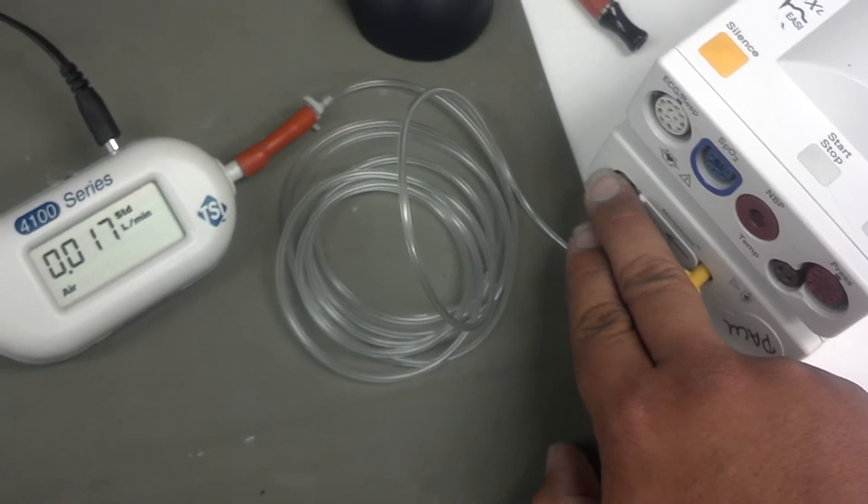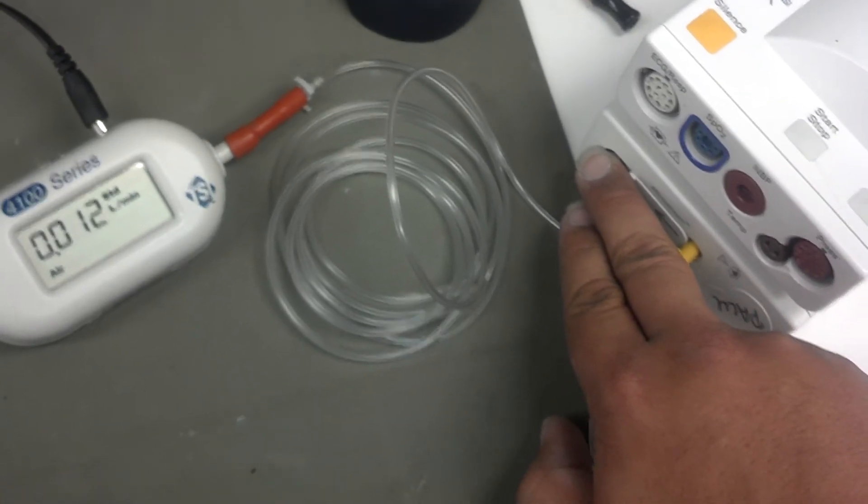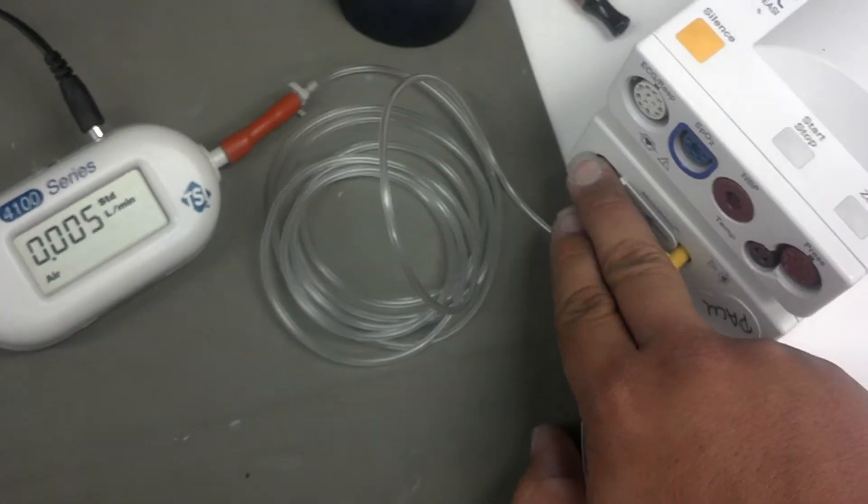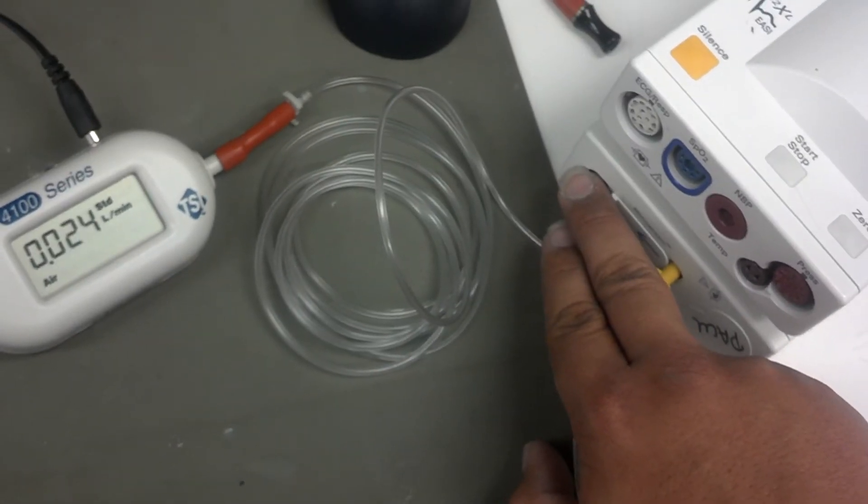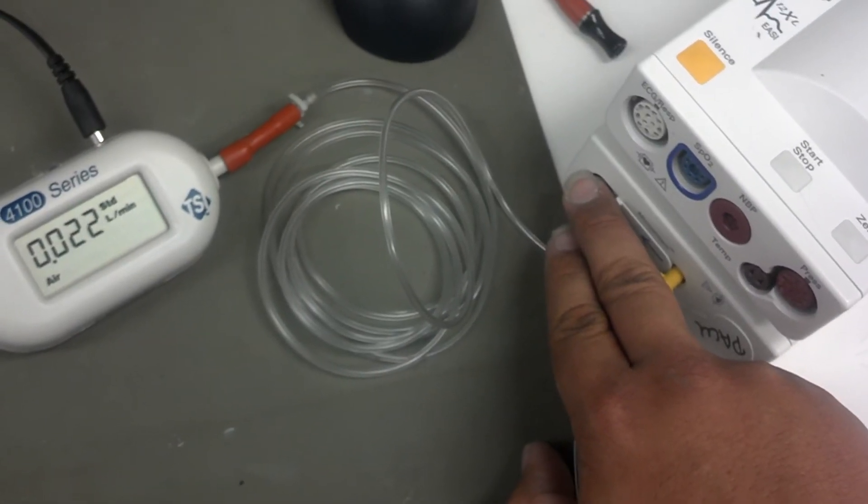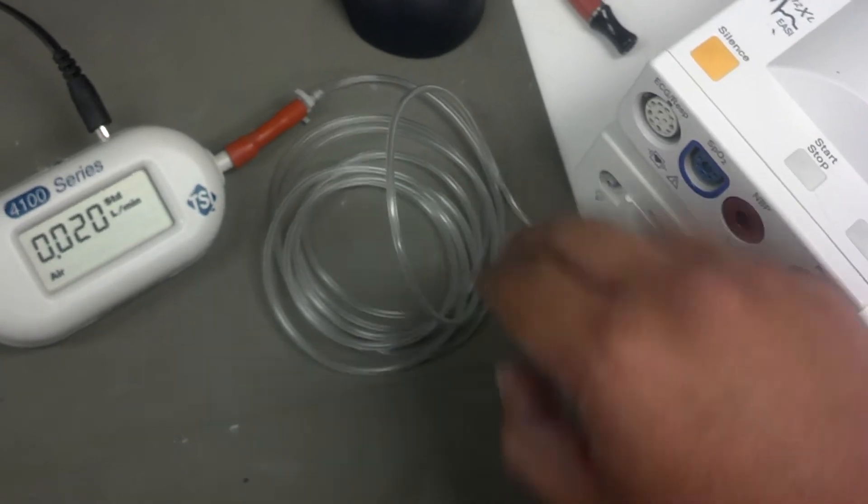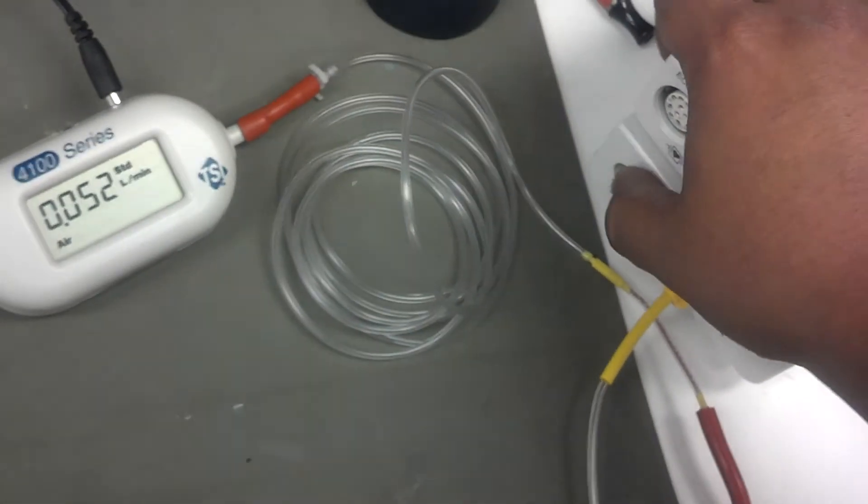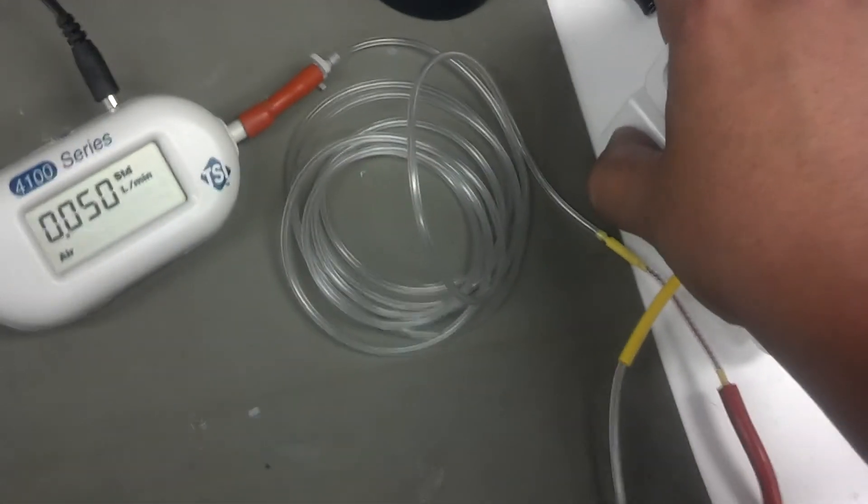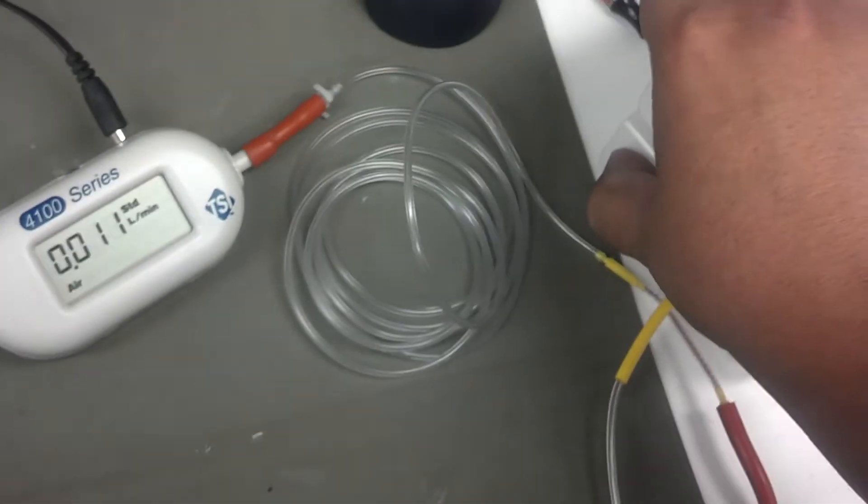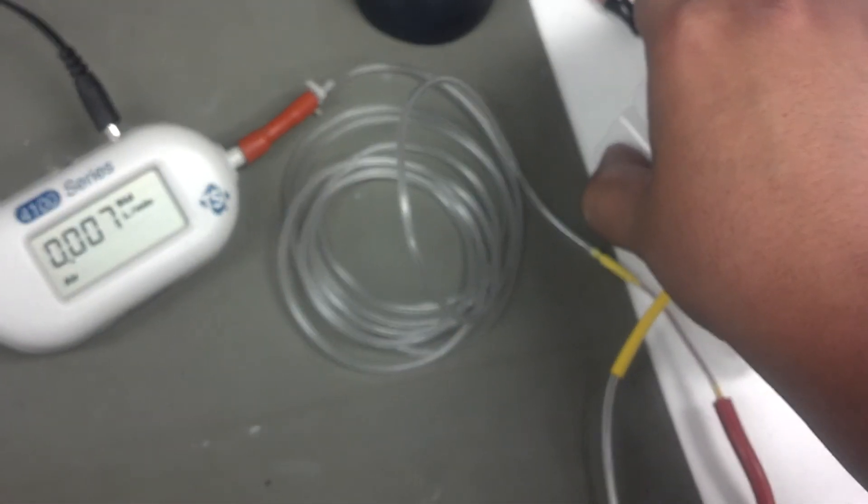If I apply light pressure, it'll display 17 or 10 or 20. Until you put enough pressure on the hole, it'll drop down to zero.